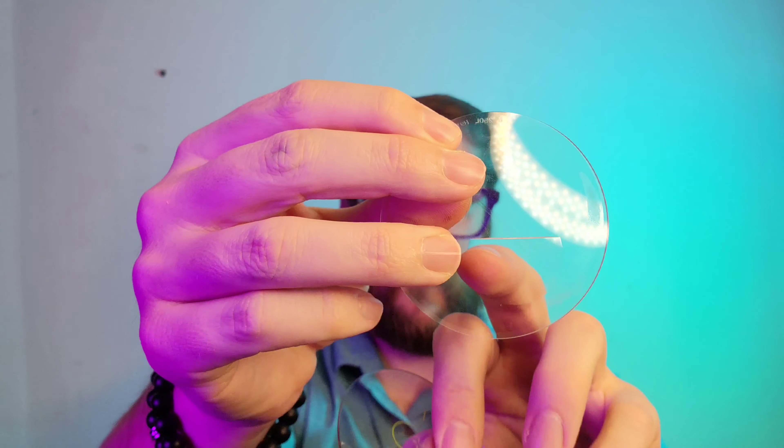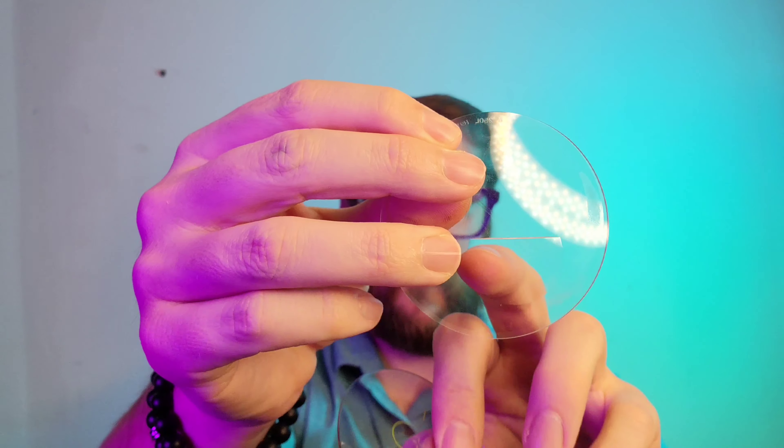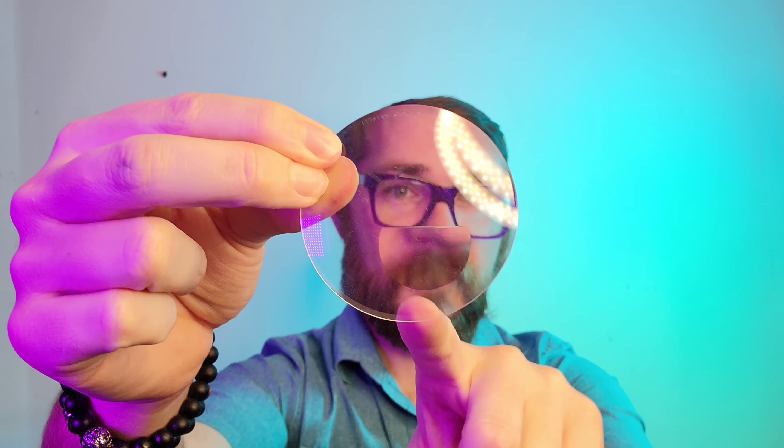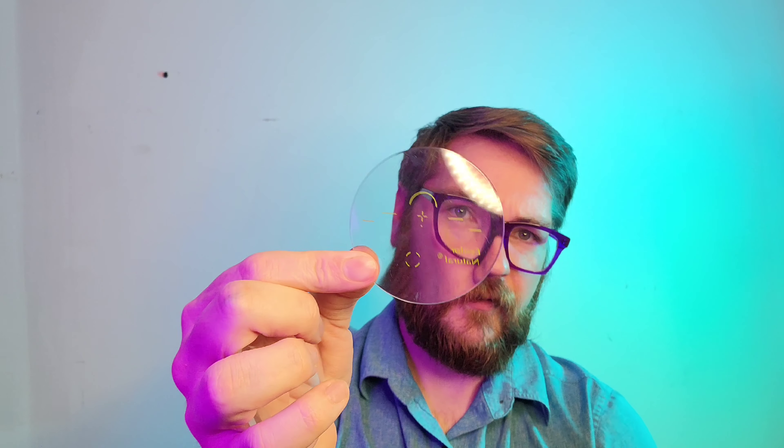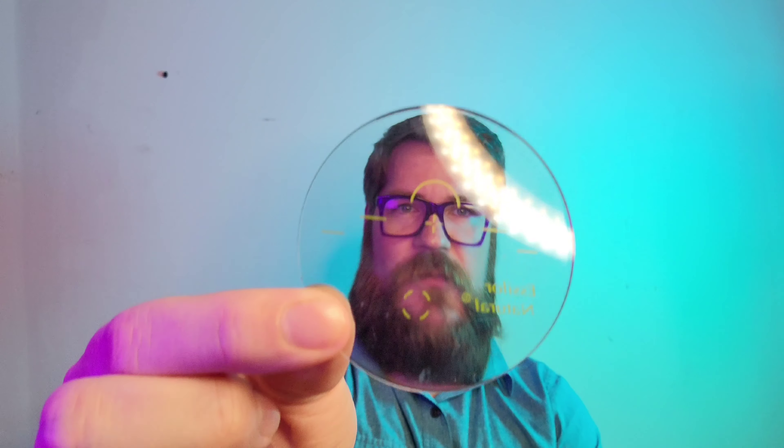Right off the bat, if you're able to see the video and you're looking at it, you can tell the magnification area is much larger on the progressive versus the bifocal, where it is just that little D-segment. The magnification area does get larger as it goes down — that's just the nature of the design. But that is kind of the basics of the two most basic options.